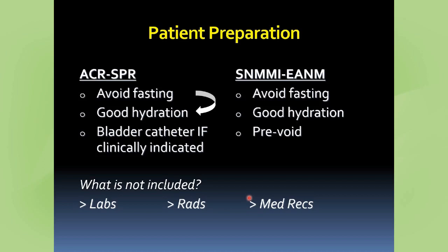If they're available, you should review them, is what the guidelines say, but there's no mandatory requirement that we need to have a creatinine within 30 days, or an estimated GFR within 30 days on these patients. There's no indication for radiology. Again, if it's available, they say review it, but you don't have to have some sort of preliminary imaging proving that they have hydronephrosis. You don't have to have an ultrasound, CT, MR, or anything of that nature. And there's no recommendations on medications in these.